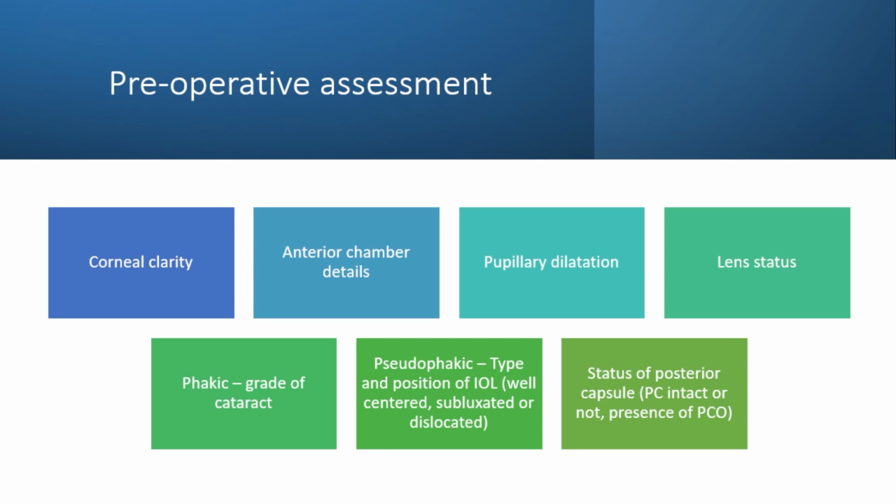These days, we very rarely do a pure lensectomy, except of course there are select cases where you should, when you want to remove all capsular remnants because of severe PVR, etc. In most cases of PVR with RD with cataract or diabetics with cataract, you tend to combine with a phaco rather than a lensectomy. And with or without IOL, you can retain the PC, put an IOL later on, but at least you do a phaco, right?